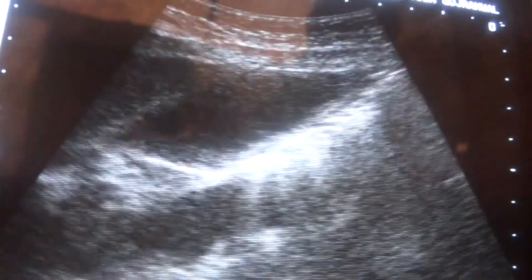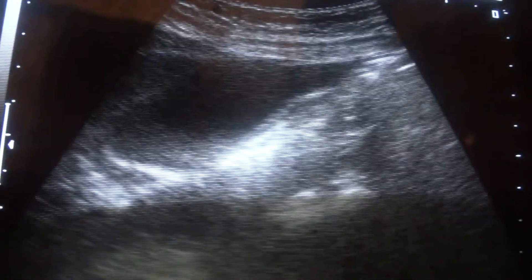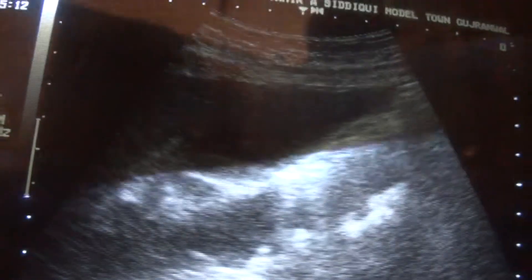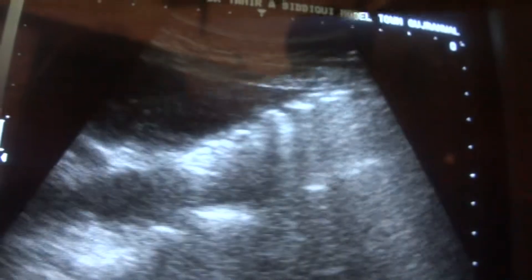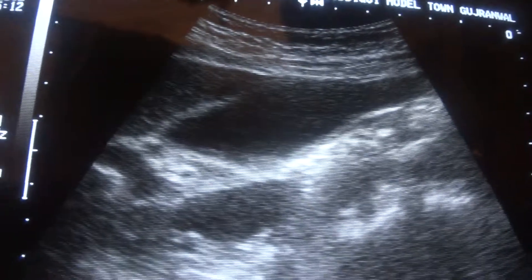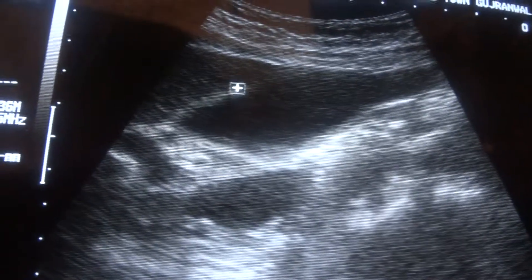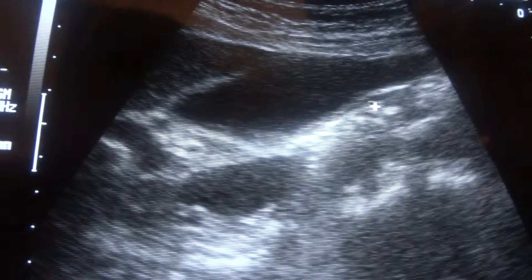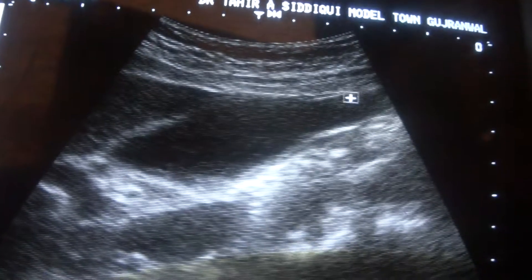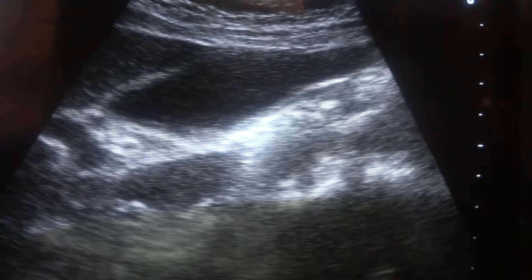Now I am going to tell you to be very cautious about the gallbladder and the bowels. It appears in this ultrasound section. This is the portal vein — the landmark for the identification of the gallbladder. This is the anterior wall of the gallbladder, this is the posterior wall, and this is the lumen of the gallbladder. It appears absolutely clear in this section.